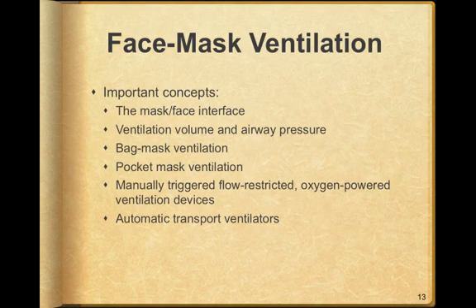Face mask ventilation. Important concepts. This is a face mask interface, and very simply, it needs to have a good mask seal. And there are several ways to do that. We got a couple pictures on the next slide to kind of show you.